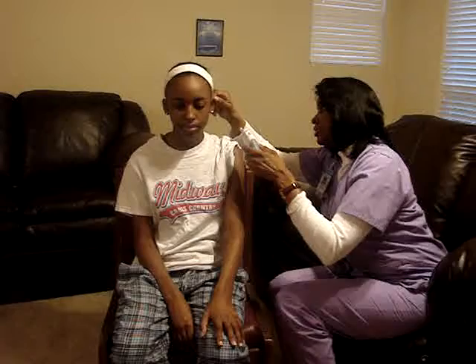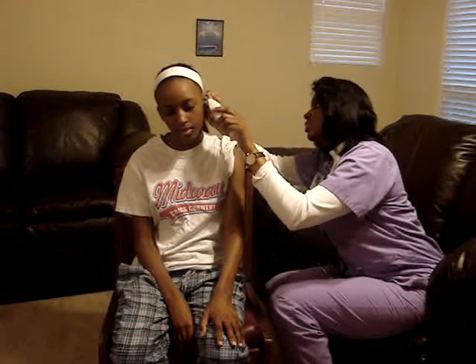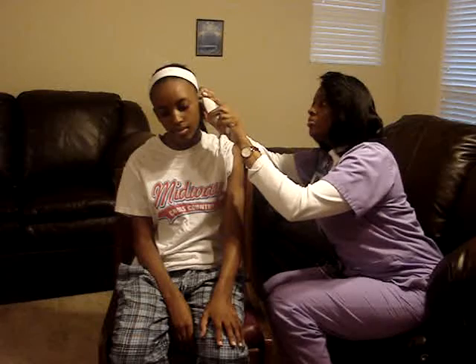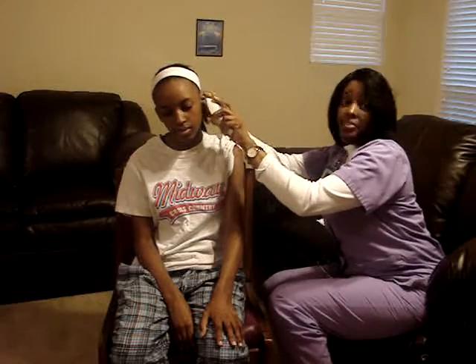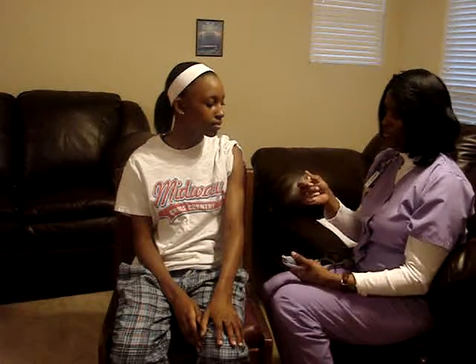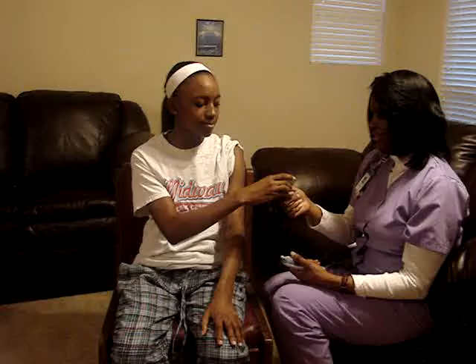Alright, Hillary, if you just lean over slightly, I'm going to put this in your ear, and I'm going to press the button and hold, and then it beeps, so we'll see what her temperature is. 99.4. Some would look at that as a low-grade fever. And to dispose of the probe, you just push that, and it disposes of it. I'll let you dispose of your disposal.